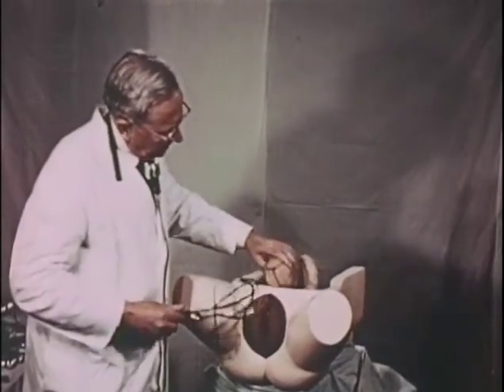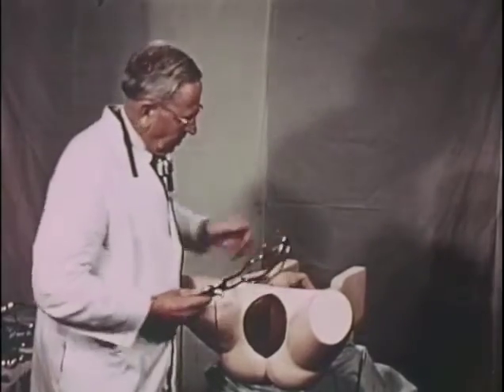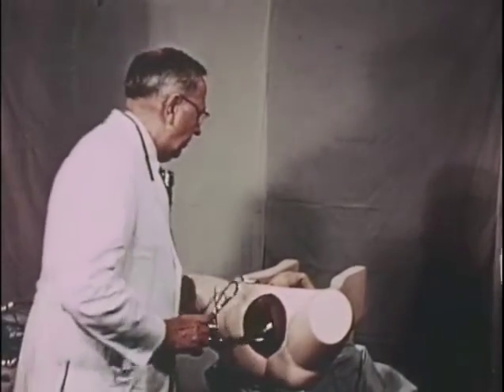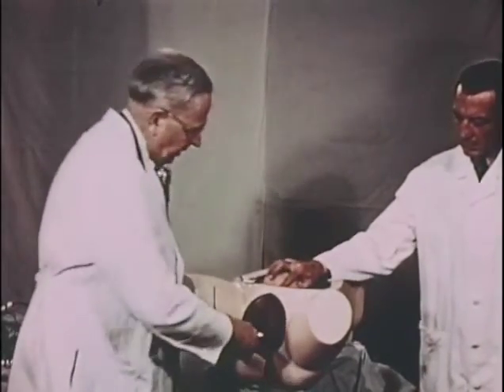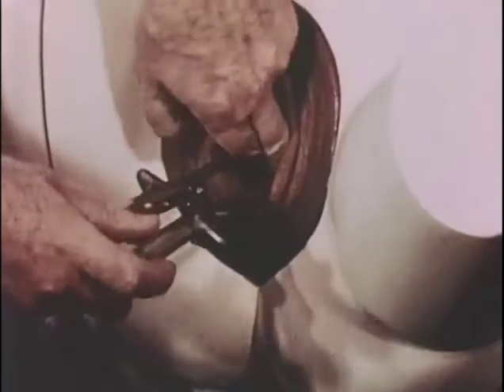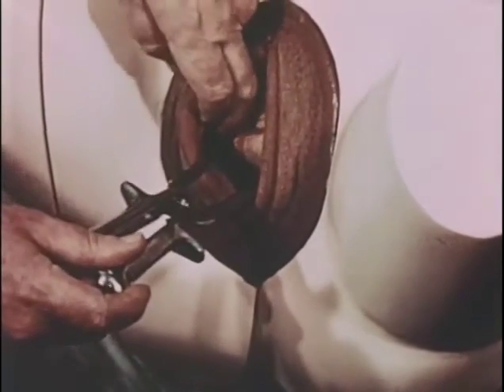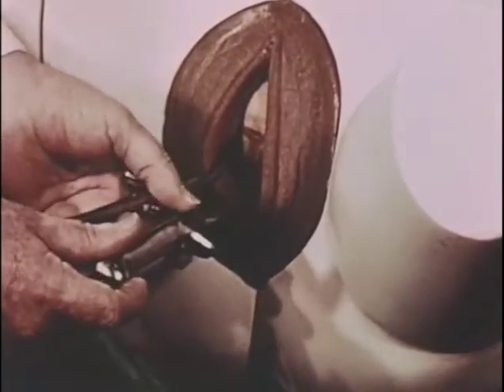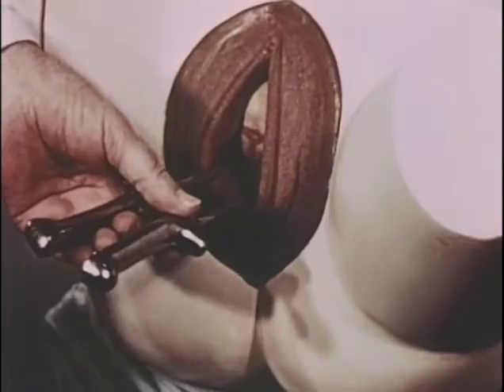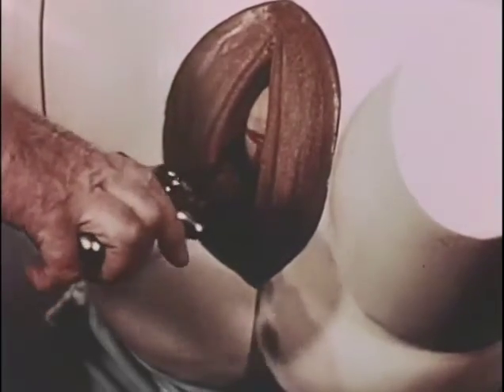The final check is for the fontanelle, and for the fenestrations, I should say. If we can put more than a fingertip within the fenestration, it means that there's a short application. And if one continues traction, the instrument may slip off because the toes are not well anchored below the malar eminences.